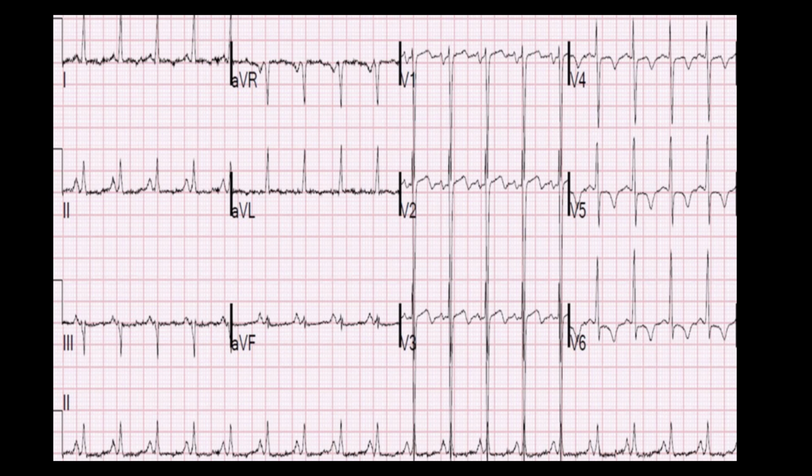For example, left atrial enlargement in lead 2, you can see a bifid P wave with the total P wave duration of usually greater than 110 milliseconds. Again, that's lead 2.